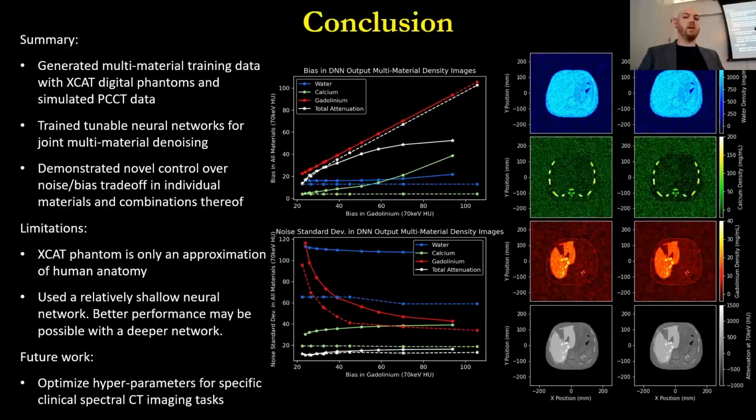I think I see what you mean. Yeah, I would like to explore that in the future, definitely. I think you can show mathematically that the maximum likelihood estimate under certain conditions is an efficient estimate. It achieves the Cramér-Rao lower bound for the covariance of unbiased estimators. So if you want to do completely unbiased imaging, I think maximum likelihood is in some sense the best you can get. But we would also like low noise. So that's kind of the idea, is you can't have both.